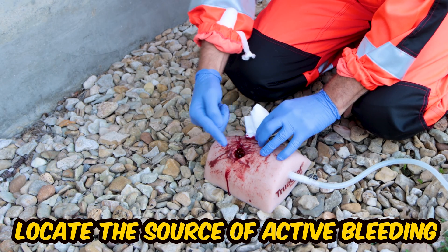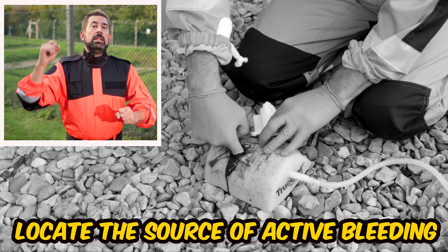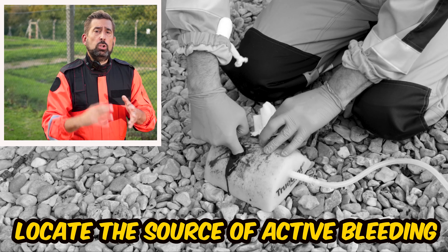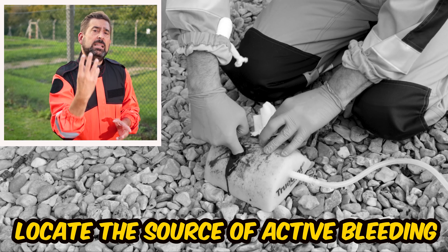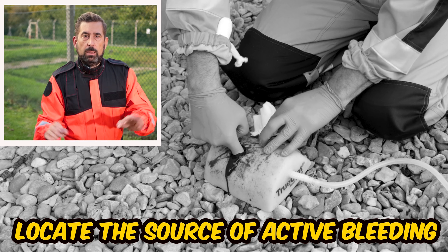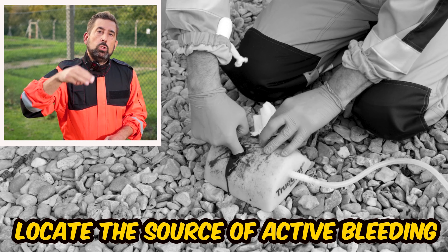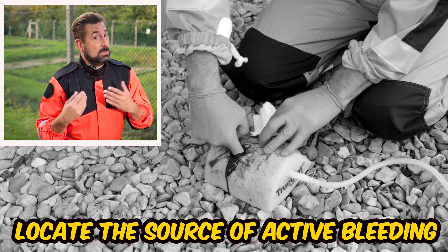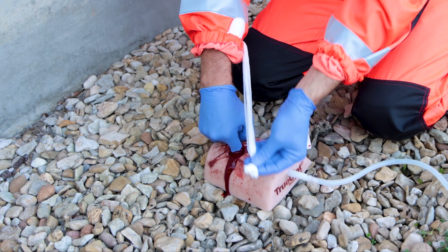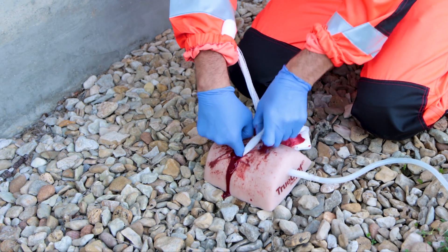Now it's time to put your finger into the wound to locate the source of active bleeding. Different textbooks say that you should feel a warm pulsating stream of blood on your fingertip, but if you are wearing thick gloves you may not feel anything. In this case — and this is practical advice outside of the guidelines — use two or three fingers to blindly block as many vessels as possible. At the moment, you are using so-called digital pressure, stopping the blood outflow and maintaining pressure inside the vessel.